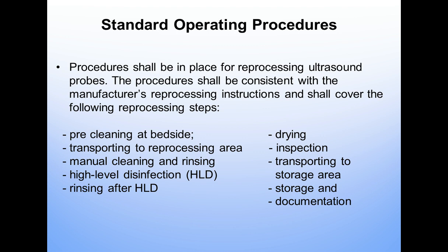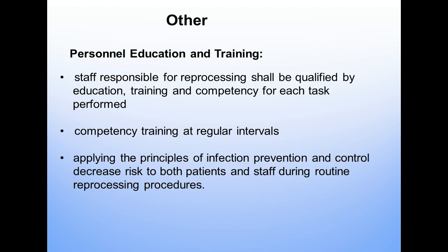But we are seeing this requirement in the U.S., and we want to ensure that we give those of you who work in these departments some evidence and basis for obtaining proper storage areas when you're requesting them. Reprocessing areas are generally very small, and so it's important that we maintain a safe environment there.